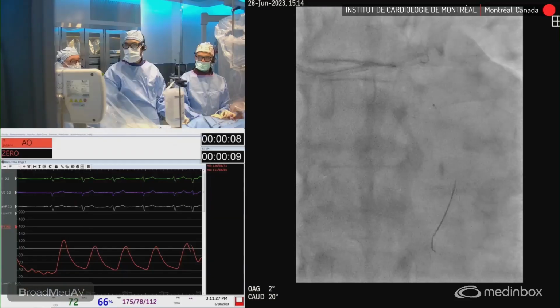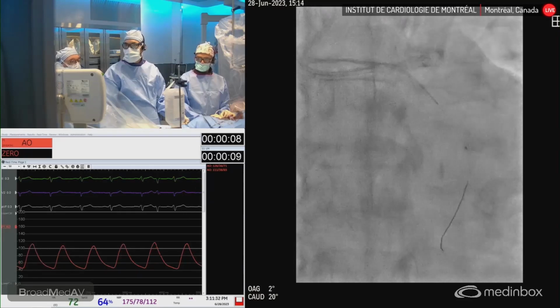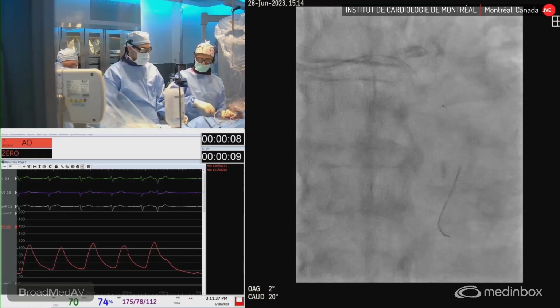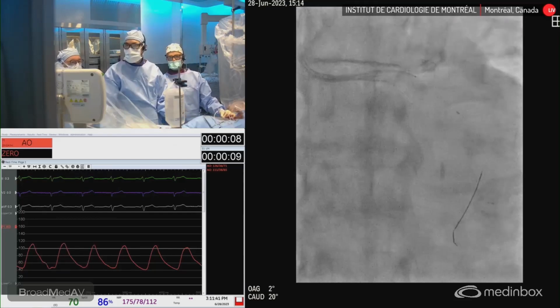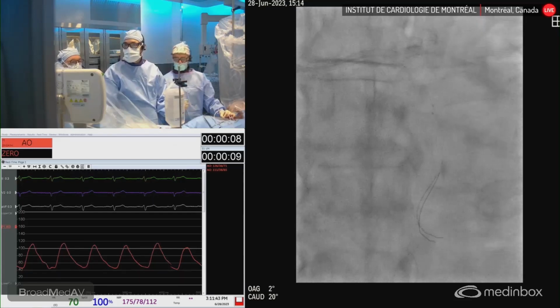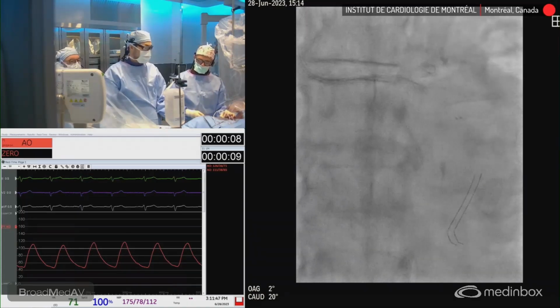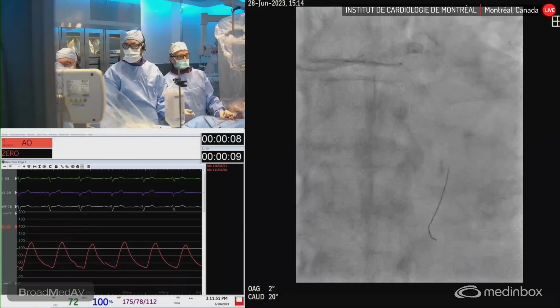So let's prepare the IVUS, and then we'll edit this case because now I want to show the balloon, because we had some technical issues with the IVUS. So our initial IVUS didn't work. We had a hardware failure. First time I get this error, but when you're live, you have to expect everything. And we're prepared. We have a different IVUS manufacturer here, so hopefully this one works.